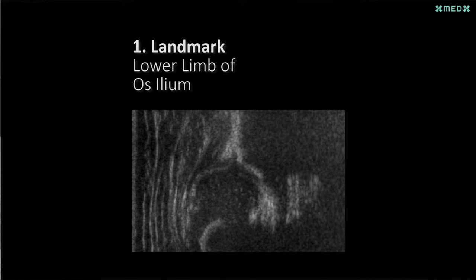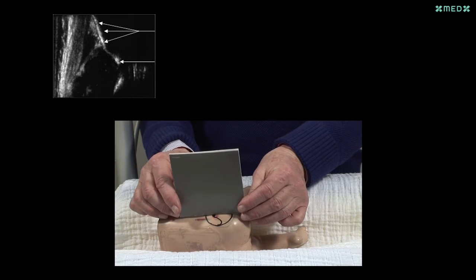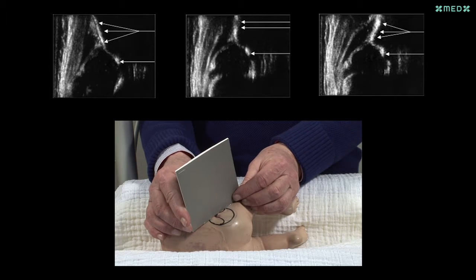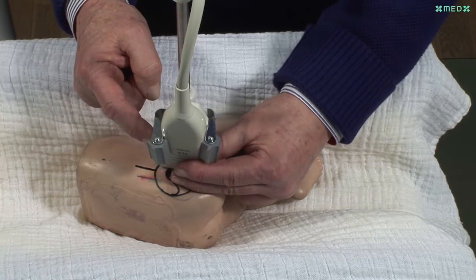When the picture is frozen with the lower margin of the ilium visible, you have to decide if your plane is too far ventral, in the center, or dorsal. It is important to find the central plane, which is called the standard plane. If you find, looking at the frozen picture, that the plane is too far dorsal, the transducer has to be rotated ventrally.